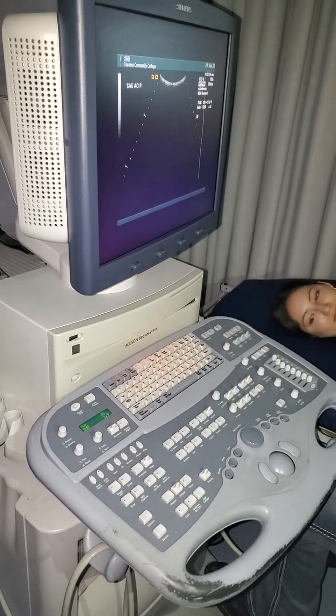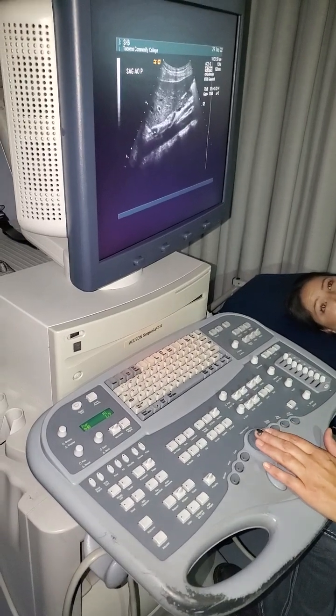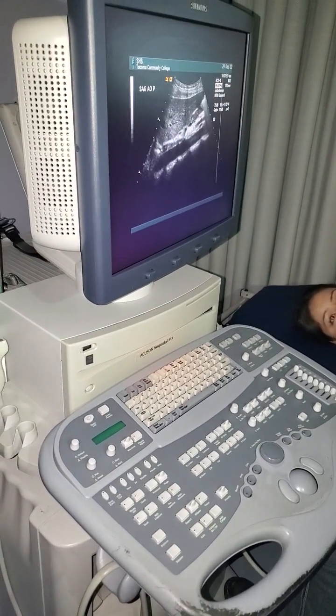And then as far as, let's get one more of you. Go ahead, big breath in again, hold it. Go ahead and breathe. Okay.